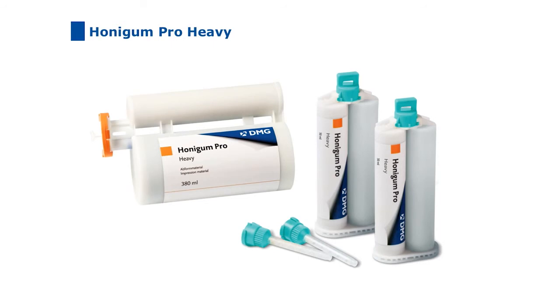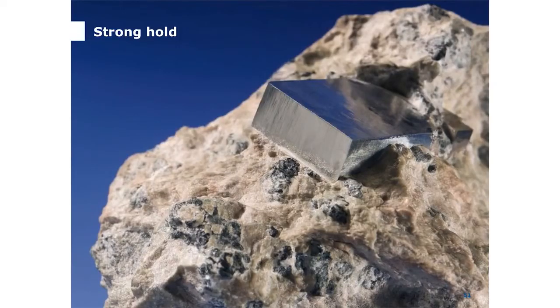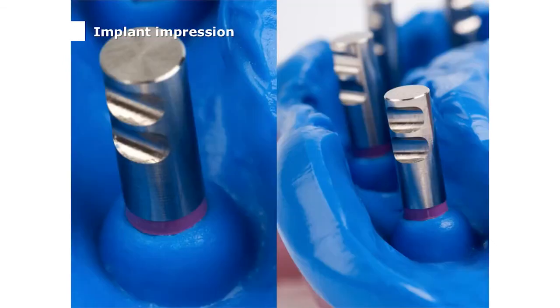Here again, we have the ideal impression material within the Honigum Pro family, the Honigum Pro Heavy. The flow properties of Honigum Pro Heavy make the syringing around and over the transfer post unique and easy, and ensure, with its final hardness of 68 Shore hardness, a safe transmission of the position of the transfer post with the impression. The perfect flow properties and final hardness assist the dentist and technician with implant impressions as well.